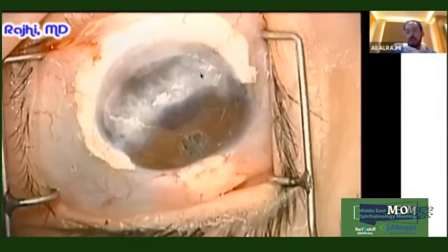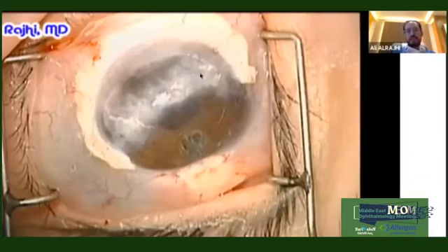And we used to do it in the 90s, when it was commercially available. They usually come in a frozen state, which is 300 micron thickness, and we put it limbus to limbus after we have 360 degrees conjunctivotomy, and then we put the conjunctiva over it. And I have other cases which are similar, with that kerato patch.